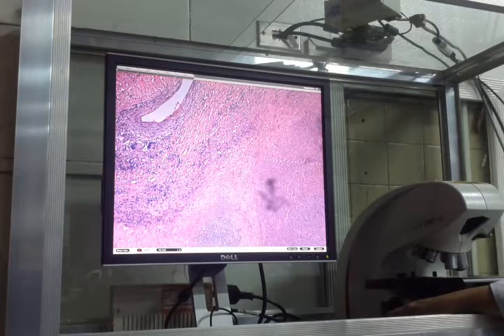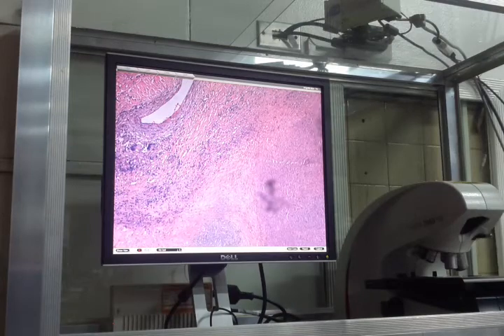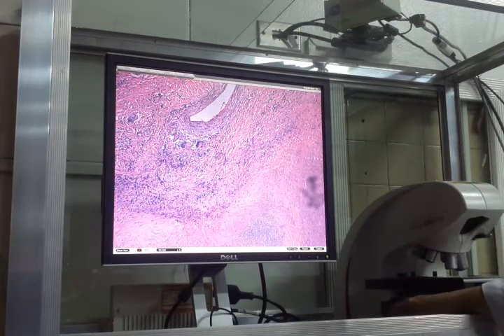And you have multinucleated giant cells over here. Right? The fibroblasts are also over here. This is caseating granulomatous inflammation. You usually see caseation necrosis at the center of granulomas.